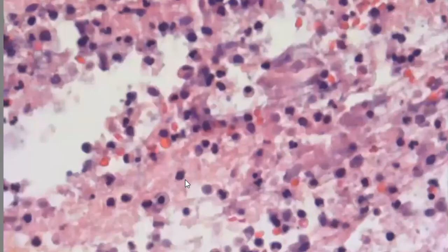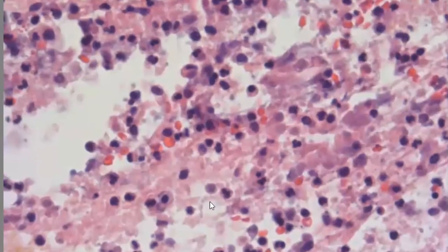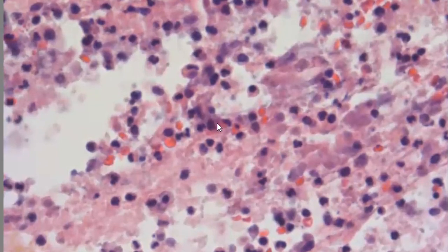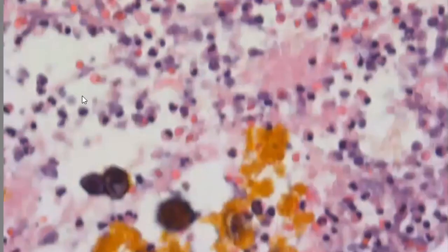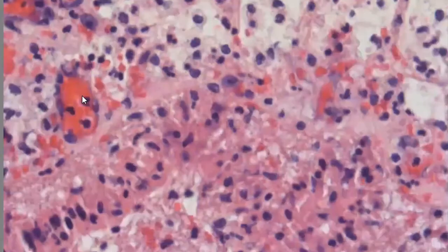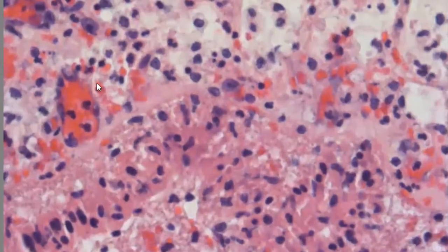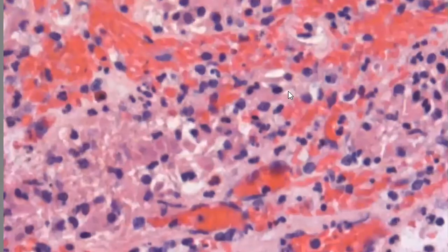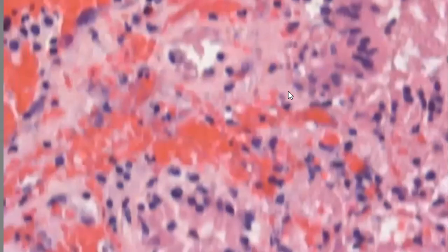This is the higher magnification, and as you can see here, we have neutrophils. These bilobed cells are neutrophils, which is a sign of acute infection. And we have also some plasma cells around, which indicates chronicity. I will just go with the higher power through the whole layers. You will find that at any place you will have this severe inflammation or these neutrophilic infiltrates and other chronic inflammatory cells. It's all present all through the wall.